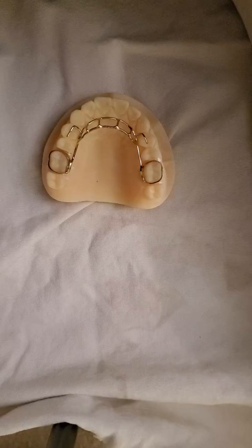This is one of my favorite appliances. This is just a traditional thumb or tongue crib. You could use it for a child that has an oral habit, like a thumb or a finger habit, or also for a child who has a tongue thrust habit.